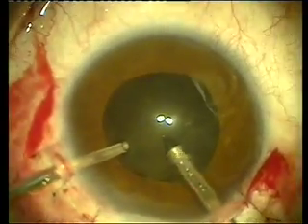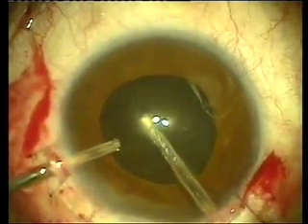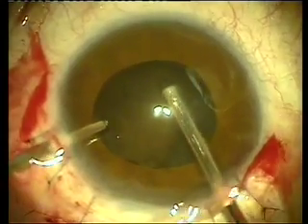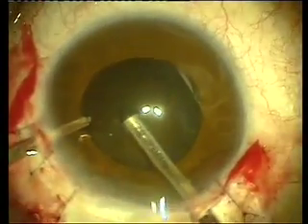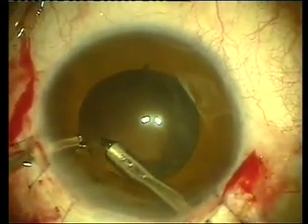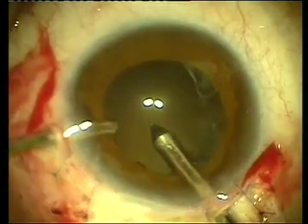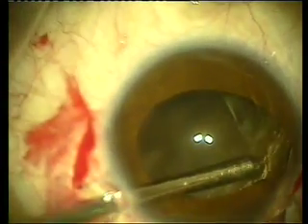Special attention is taken not to create significant astigmatism by tightening the wounds. We have placed some Kenalog into the posterior chamber in order to perform an anterior vitrectomy. The Kenalog will help with making loose vitreous visible and readily visualized by the surgeon.